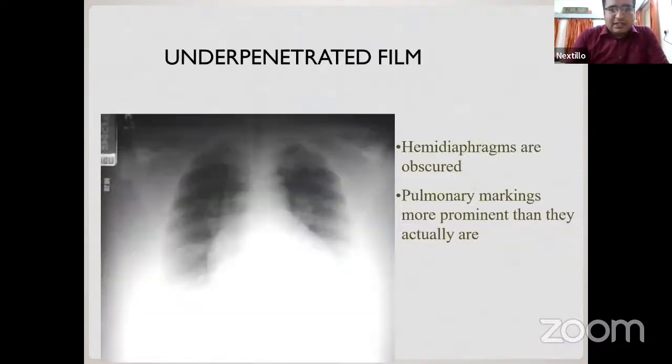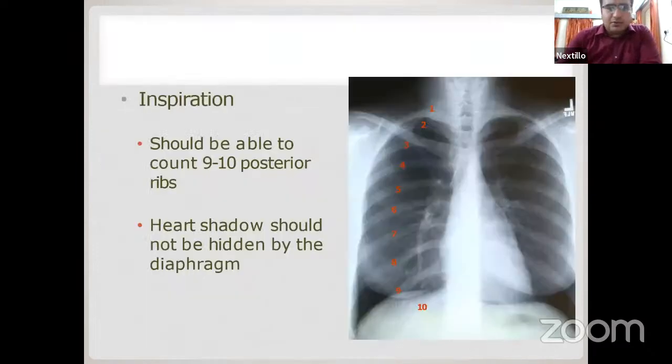Now let's move to the next. Look at this. This is looking white. After this class, you would be like, sir, look, pneumonia. I would be like, no, under-penetration. Always remember that. Always look for the penetration. Otherwise, you are going to misdiagnose. Don't get bored. If anybody has any doubt, you can ask me on YouTube.